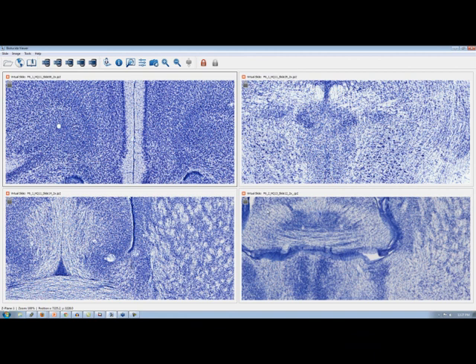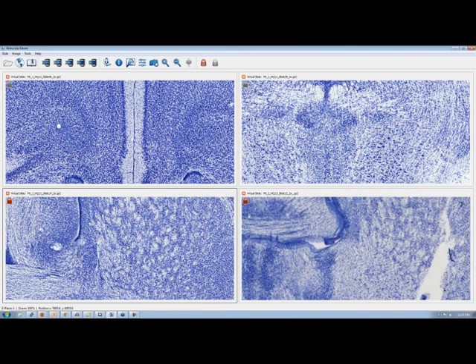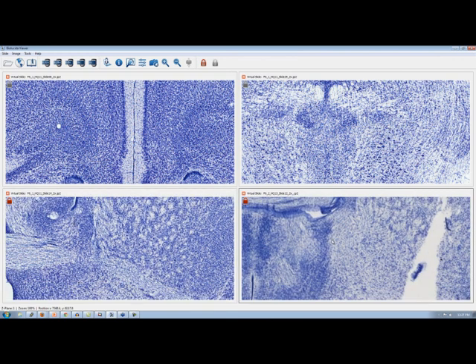If you want to synchronize them, there's a little lock that shows up on each of these images. We can click synchronize on any number of them that we want. And after that, once you move one of those images, the other image will also move. And that works no matter which of the synchronized images you're on. That's so great, because now I can go across my tissue in a very organized fashion and have on both images the same region of anatomy and compare it.